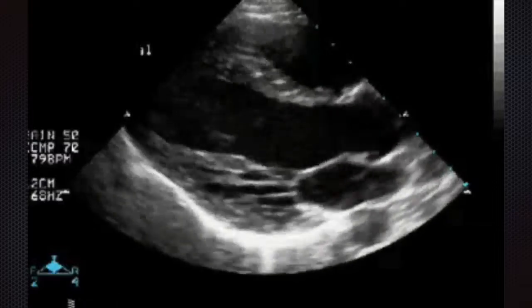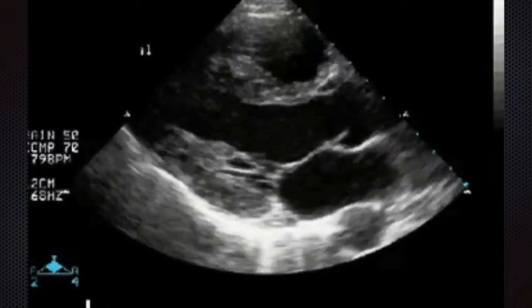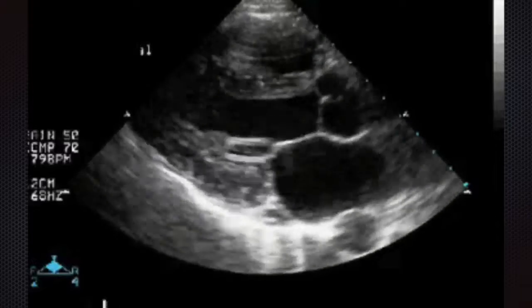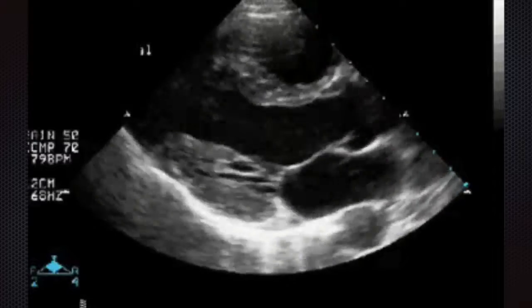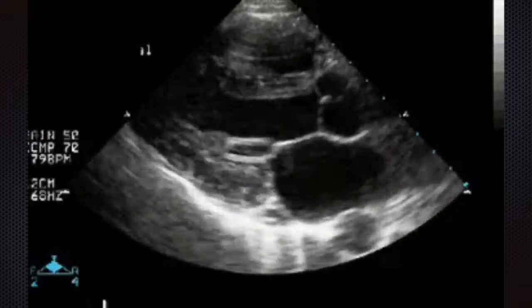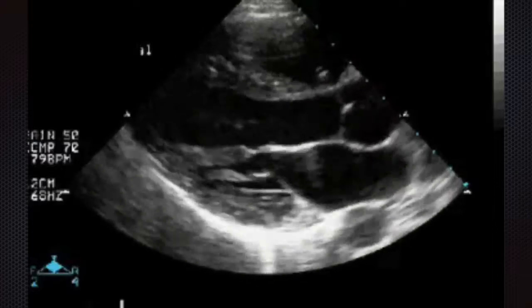And often you can do measurements of these things, but really just by looking for the thickening of the left ventricular wall area of interest you're looking at. So at the top that's the septum, at the bottom it's the posterior wall. You can see if it's functioning normally. And as we said before, parts of the left ventricle are supplied by different arteries. So for instance, there might be a septal or anterior septal or apical problem if there is a left anterior descending occlusion. And sometimes you'll see this well before any ECG changes on echo.